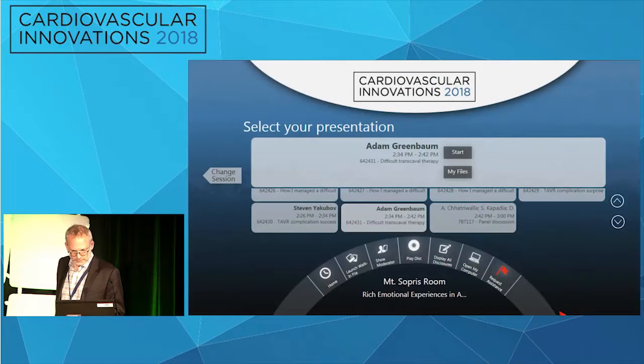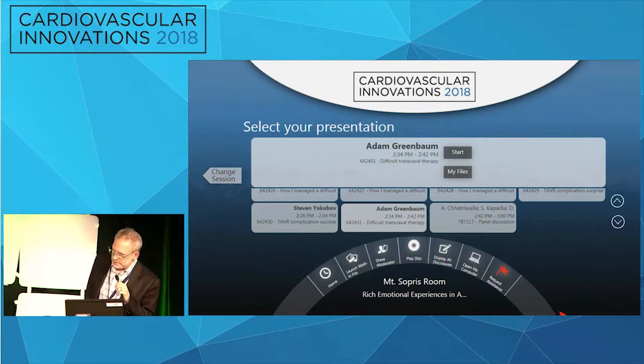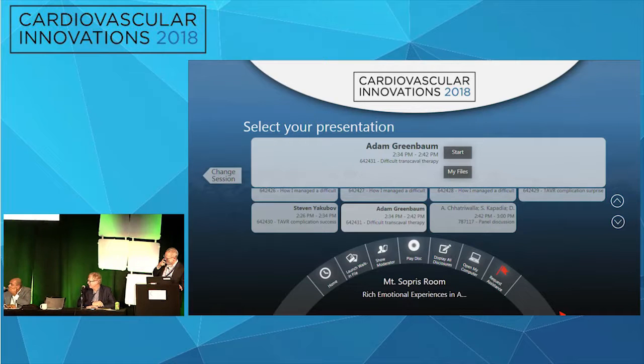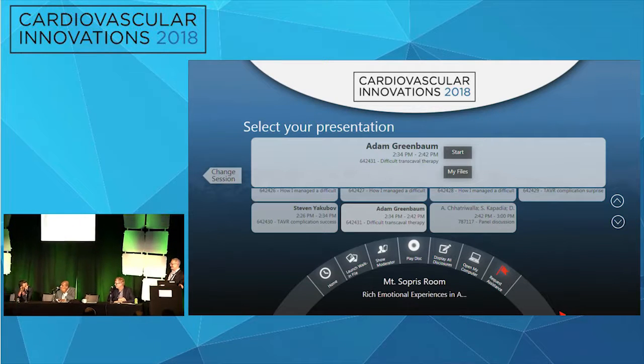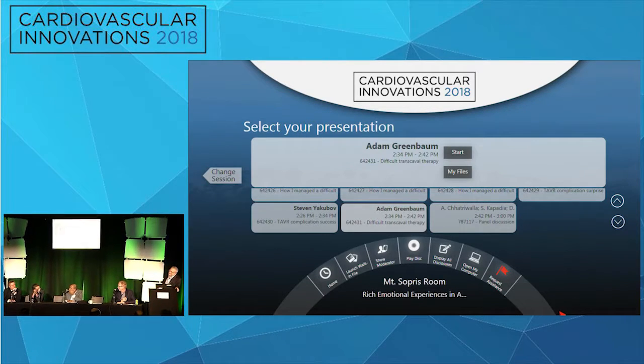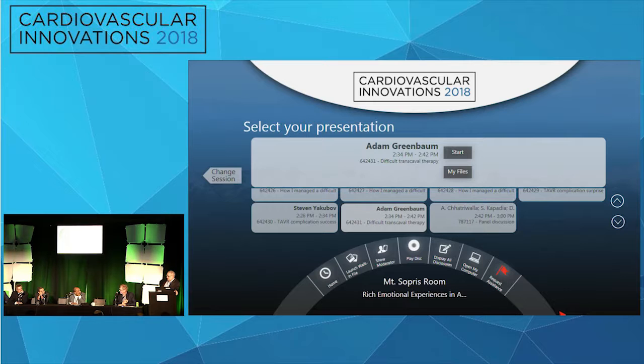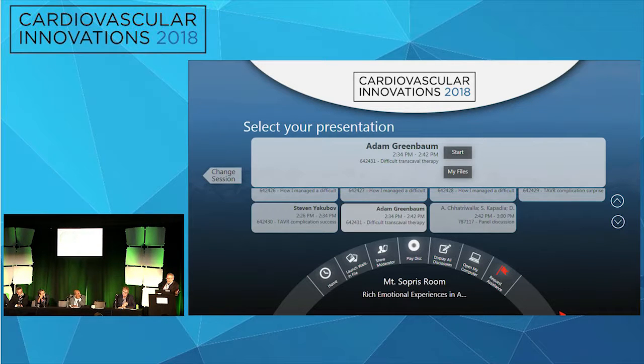So, Adam, the stent graft is 14 French, right? Yeah, so that's a 14 French. Right. Well, we've been up to 22 French dilators, right? No, but my point is that if you can put a 14 French sheath, you could potentially... Not necessarily, right? The Endologix iliac limb extender is a 12 French capsule. It's pretty hydrophilic, pretty slick. You just need a 3 millimeter vessel to get it up there. And you could just balloon real quick if you needed to.